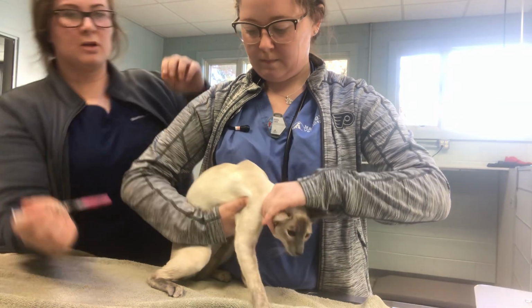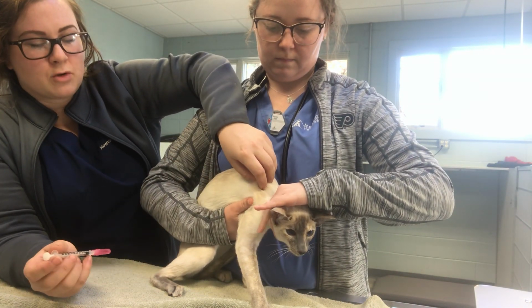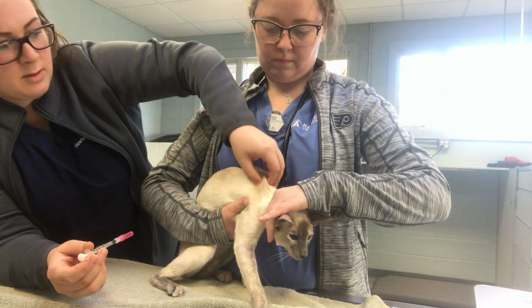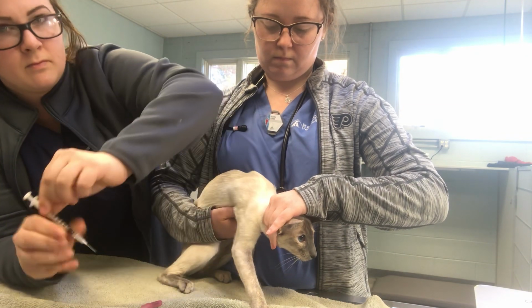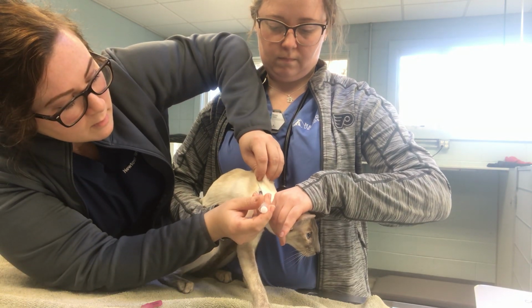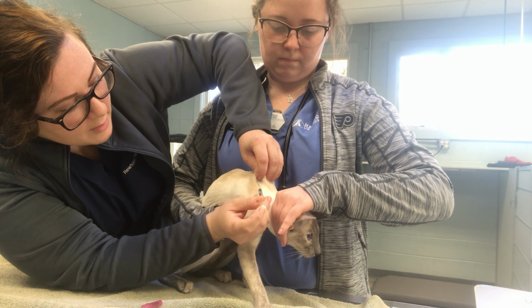All right, so we have our patient. We're going to be giving it sub-Q, so I'm going to go up here. We're going to tent the skin, inject, draw back, inject as long as there's no air or blood. Just find a good spot. So again, tent the skin, inject, draw back, no blood or air, and we're going to inject.